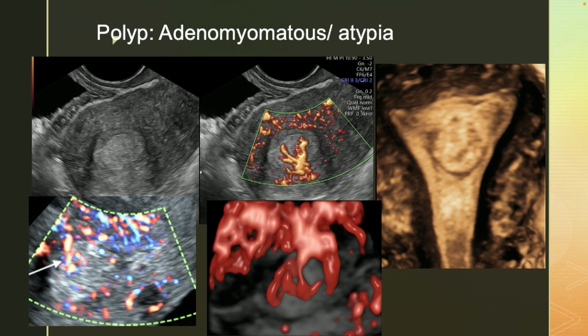I would tell you that for more than about 10-12 years, we have stopped doing any diagnostic hysteroscopies. All the diagnosis can be done only on ultrasound. Hysteroscopy is only done for therapeutic purposes.